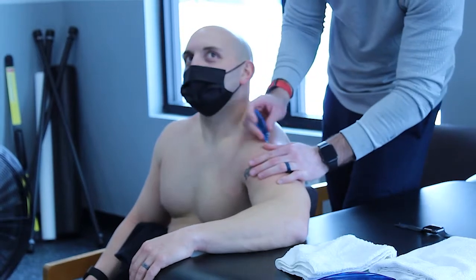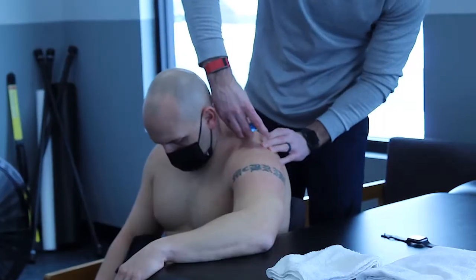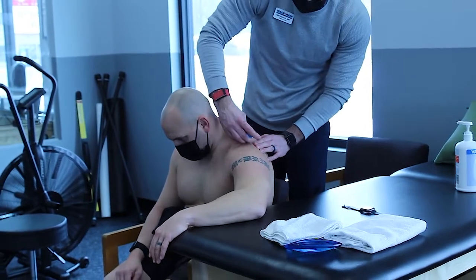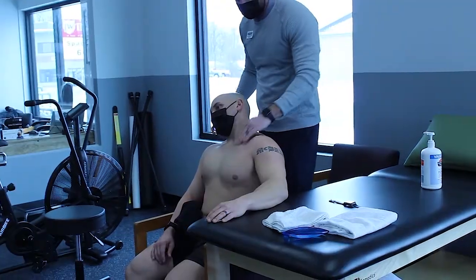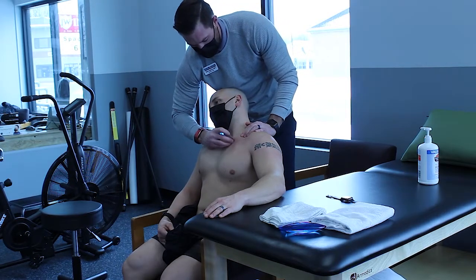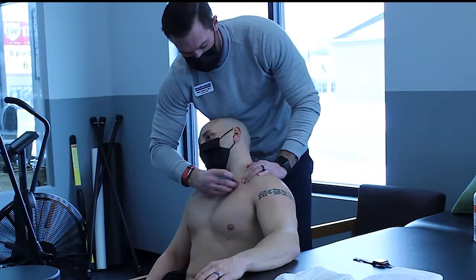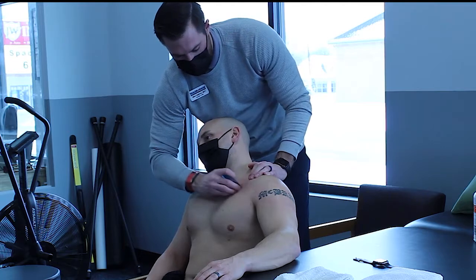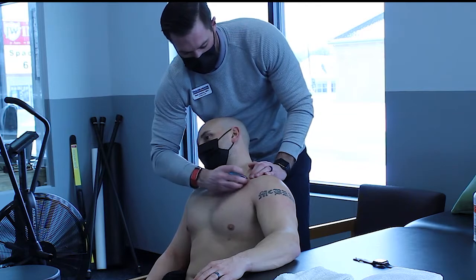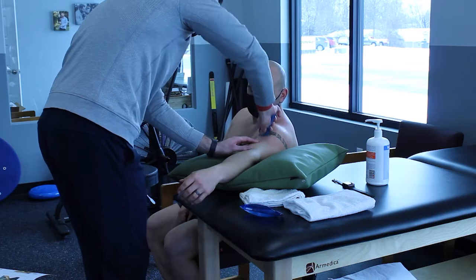Right now for this patient, we're working over the AC joint as part of his upper extremity treatment. Releasing antagonist muscles is an important part of Astym as well. Getting rid of tightness through the pecs can help the scapular muscles initiate motion and allow for a good stretch and normalized position of the shoulder.